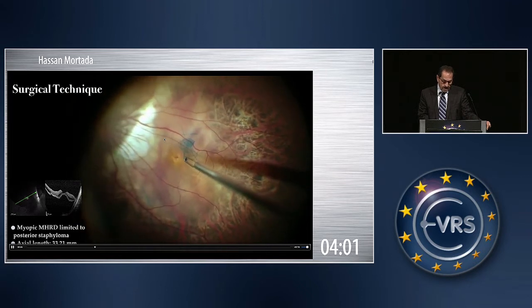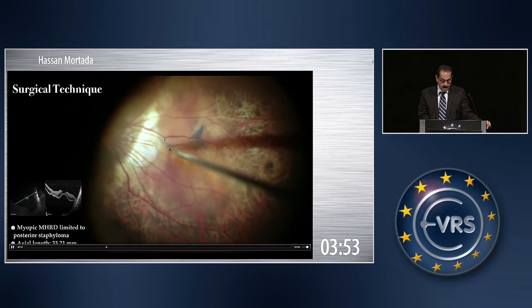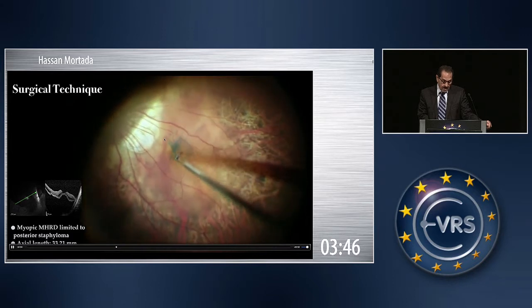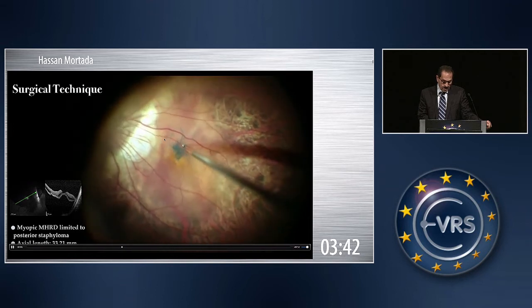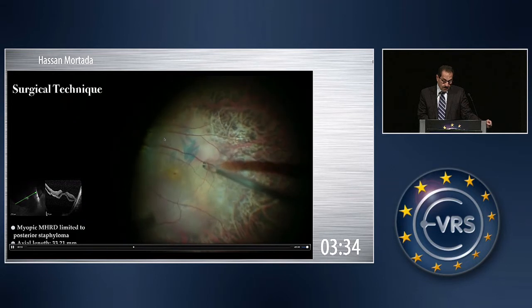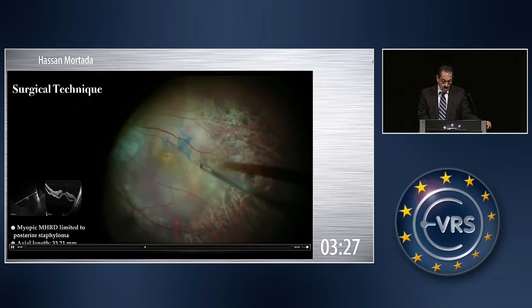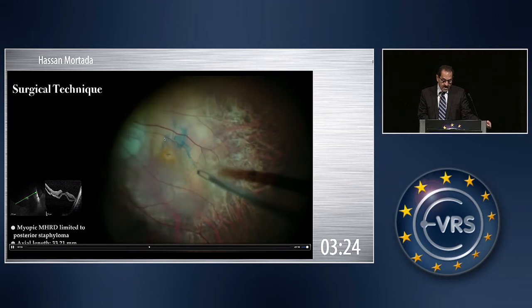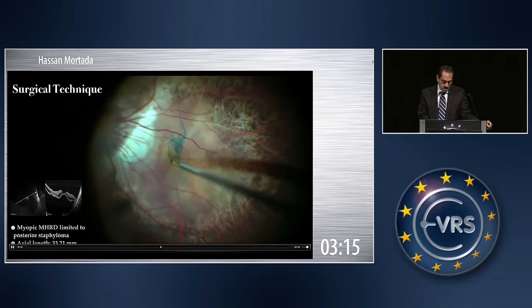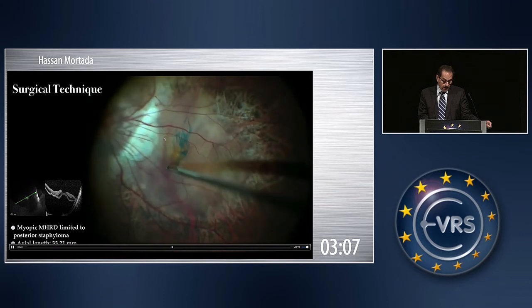I usually start far away at the arcades in order to prepare a flap, because you may lose the flap at one time, and then you have sufficient ILM to complete the task. The ILM is accumulated over the macular hole. Every time you peel the ILM, you have to allow the retina to recover from traction forces. Sometimes you have to augment the staining, and whenever you cannot identify the ILM, inject again to complete the task perfectly. Here the ILM is peeled towards the macular hole.